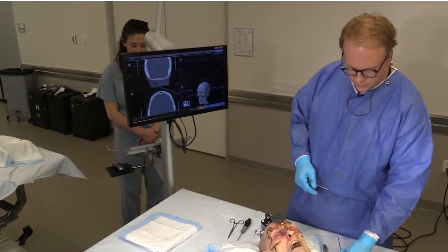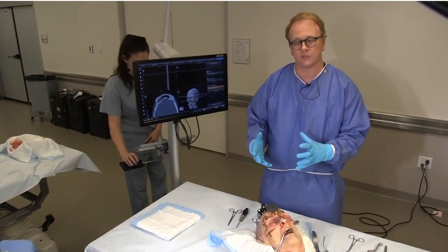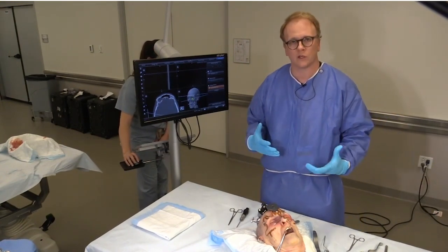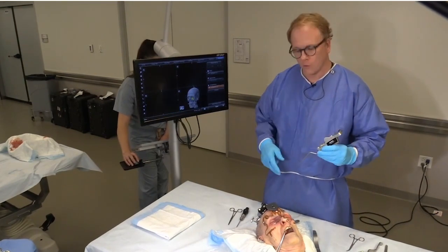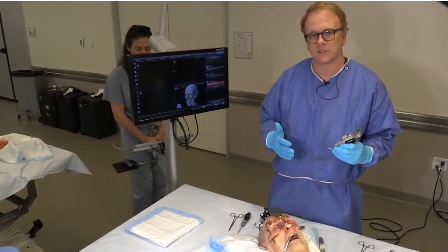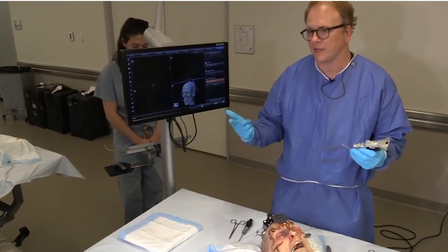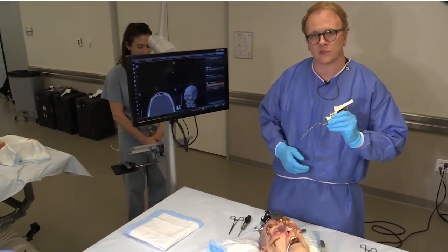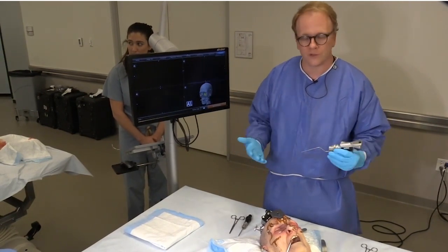The second bit of utility with navigation for orbit trauma is in guiding your reconstruction and confirming its accuracy. The simplest approach: after you've placed your orbital implant, use your navigation probe, place it on your orbital implant, trace it over the implant, and decide if that's an adequate reconstruction of what the orbit should look like. This doesn't require any special software or planning — just place the probe on the implant, make sure it's on solid bone, not sitting in the maxillary sinus or the ethmoids.